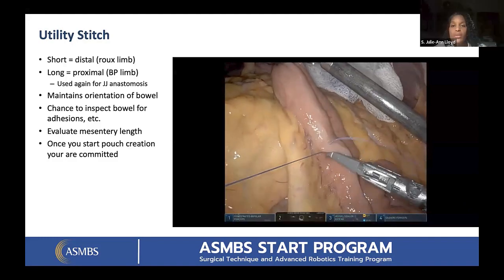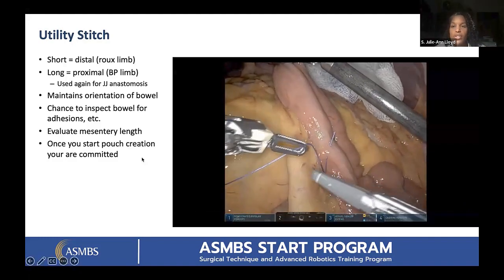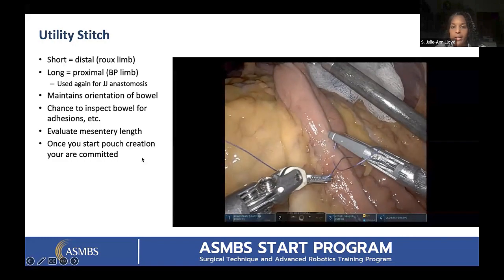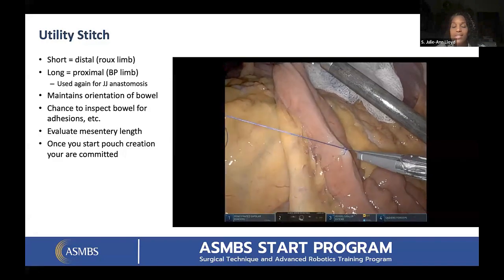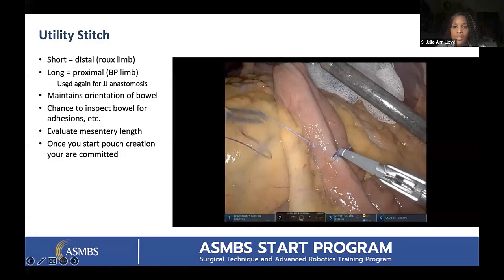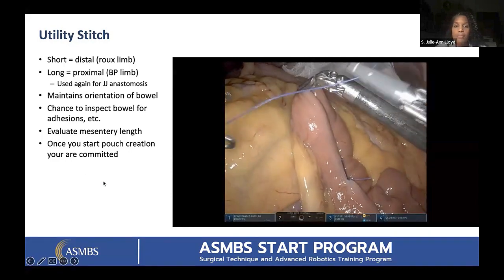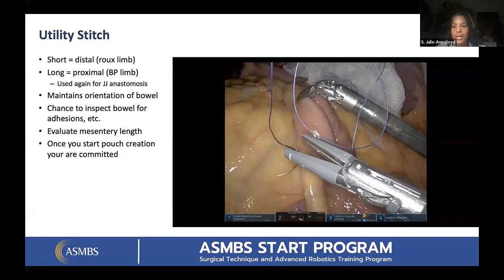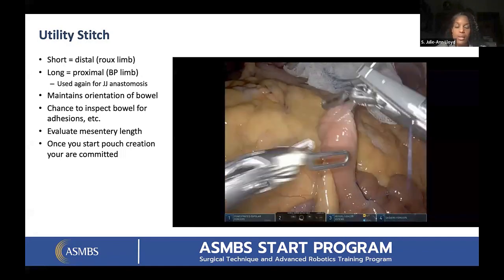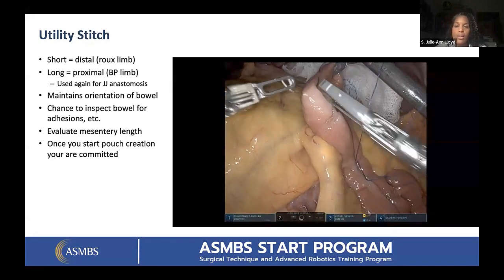So I have to say, usually when I'm doing a bypass, there are a couple of times during the operation when I ask not to be disturbed by any of the staff. It's like measuring the bowel, and then once we get the orientation, I actually don't do the suturing. I think this is pretty nifty though. But once I start doing my anastomosis, I just make sure that I maintain orientation. So this is, as Monique was pointing out, one of the critical portions to be very focused.